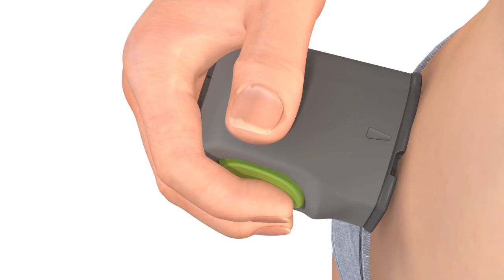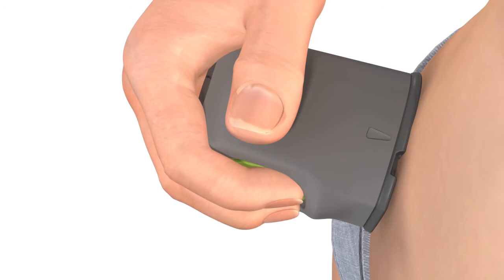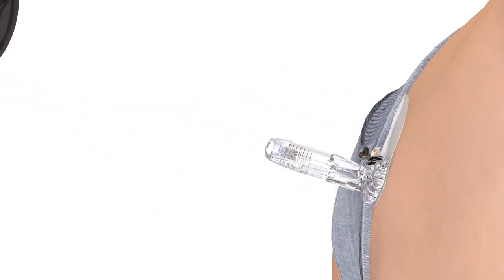Then, press the small bump on the green button a second time and continue to hold it in while you slowly pull the Sertor away from your skin.